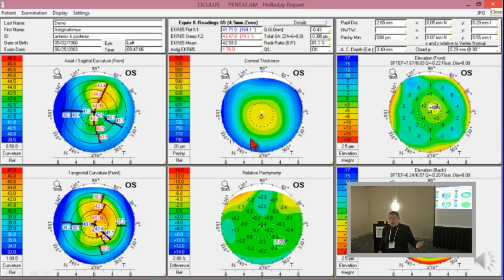But you'll end up with myopic surprises of a quarter, a half, or whatever. So all I'm saying is that there's nothing wrong with doing that, and that it is always better to err on the myopic side because the patient has some place to see. But if you go back and you plot those, what you'll see is you're on the myopic side of that, and that's nothing wrong with that because I tell people that's a good idea.